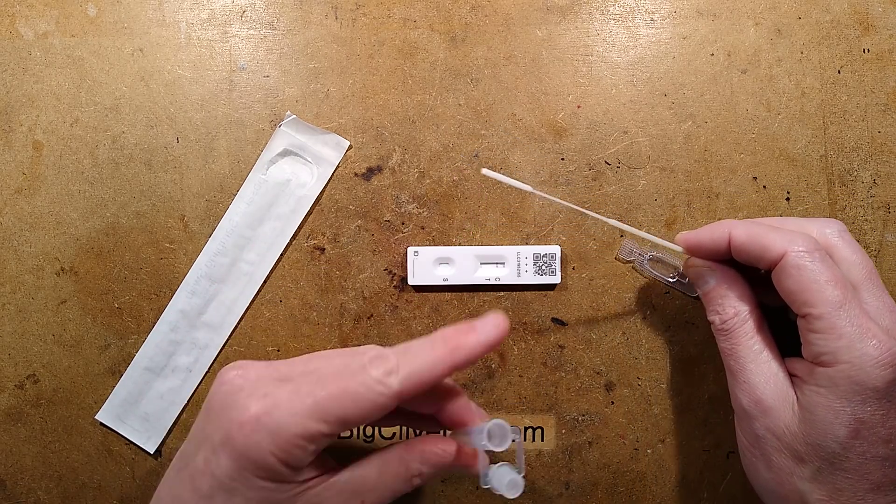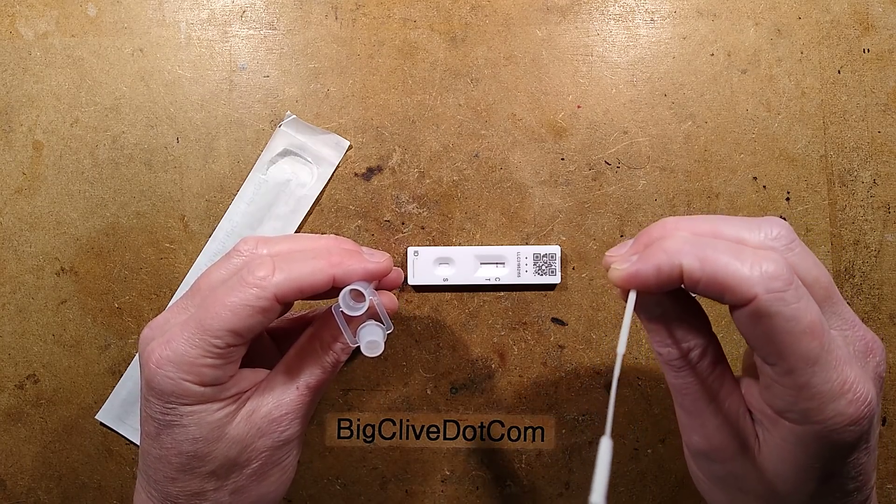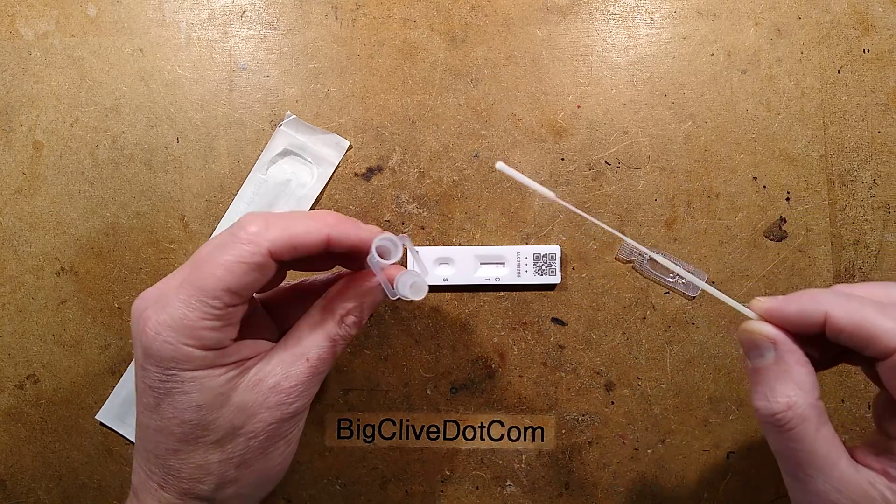Then you stick this up your nose and you twirl it around in one of the nostrils, but you have to push it right far to the back and you'll probably sneeze as well. It's very intrusive.